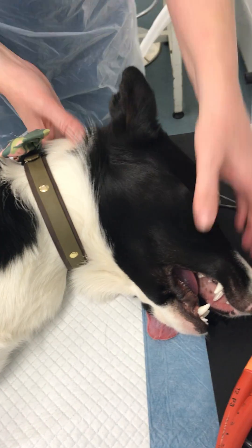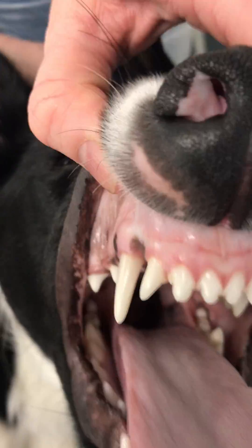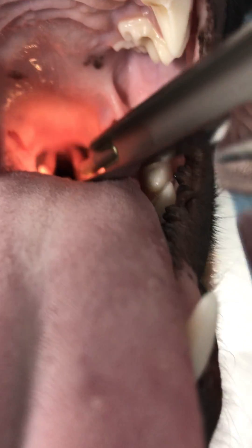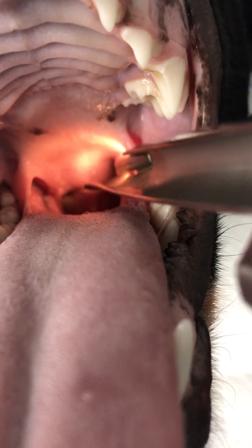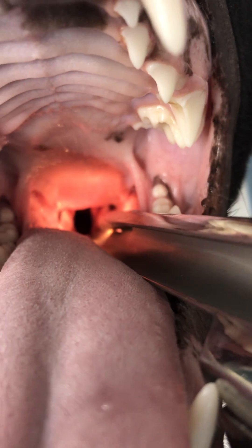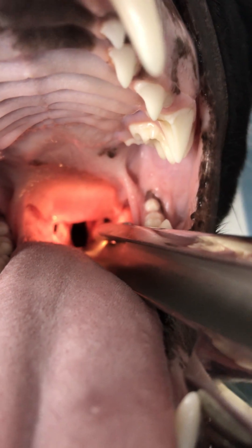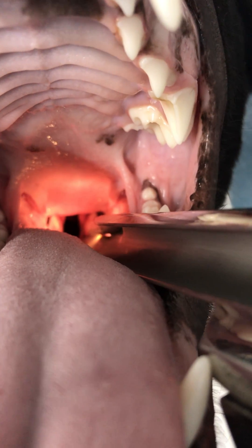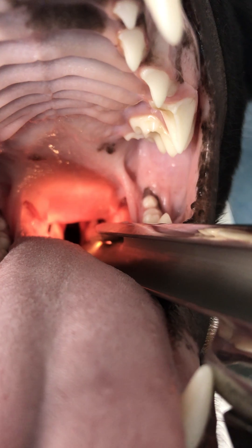So I'm going to show you guys — in here, there's his airway. This is his epiglottis that I'm putting down, and that's his airway. You've got the larynx at the back down there, and that's where we're going to put this tube. We're going to pull that down, do that, and then go from there.